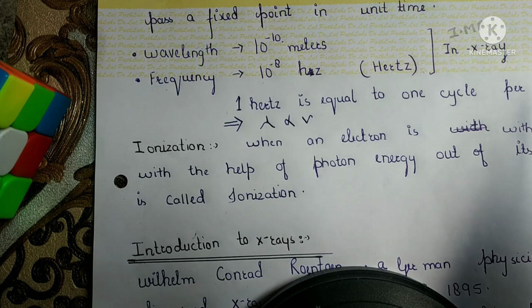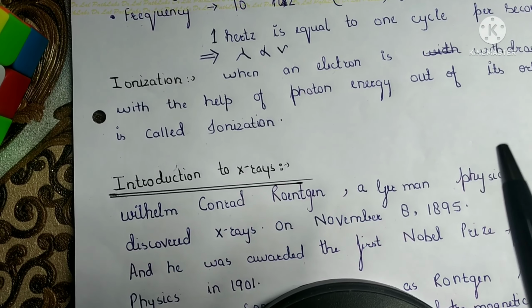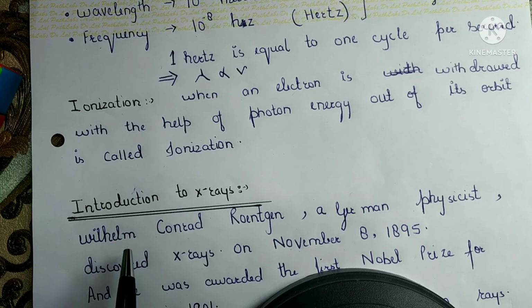Let's move forward towards the topic introduction to X-rays. Whenever we talk of X-ray, in our mind comes the one who discovered them. The one who discovered X-rays was Wilhelm Conrad Roentgen. He discovered X-rays on 8th of November 1895.